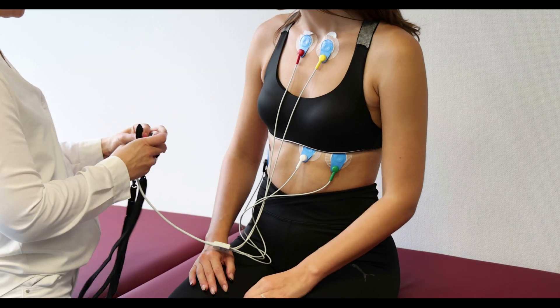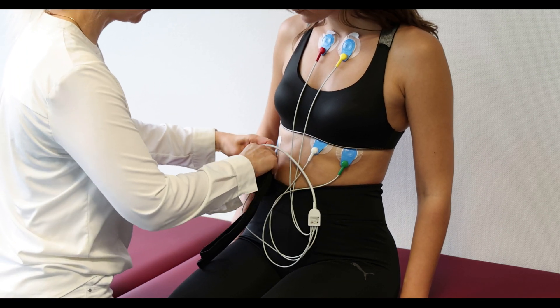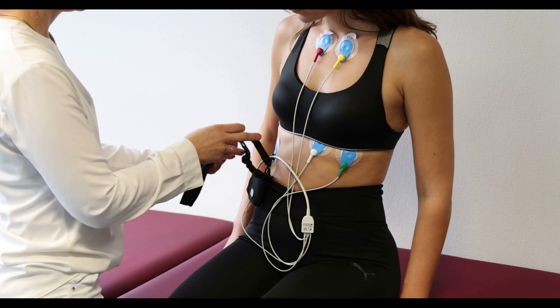Place the recorder in the carrying case and demonstrate to the patient the different ways of wearing it, on the waistband or with the strap along the neck.